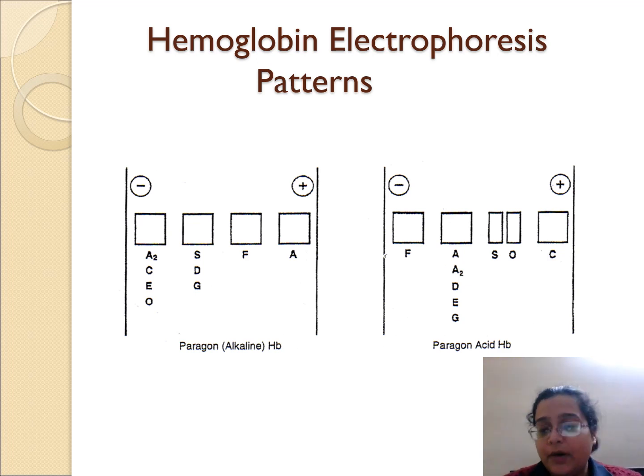I just want to wrap up HPLC with a few other common as well as uncommon hemoglobinopathies, as well as what other uses of HPLC we have in medical practice, not in routine basic sciences. I'm going to show you the graphs quickly, so that this will be a kind of a small handbook for you, a video log kind of a thing, where you can quickly refer to what a graph looks like, where we see the basic values and how we interpret.